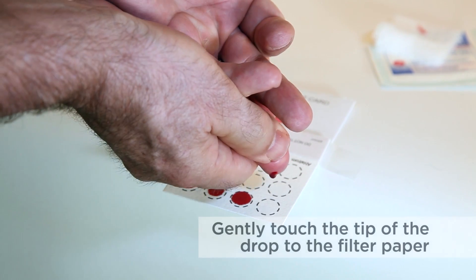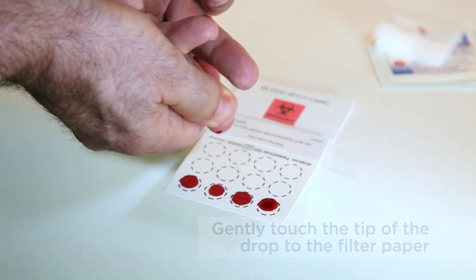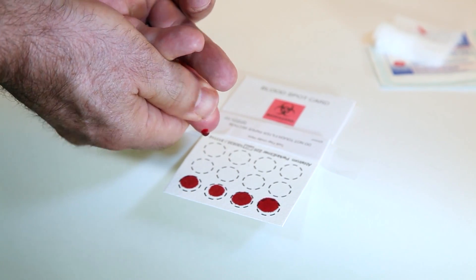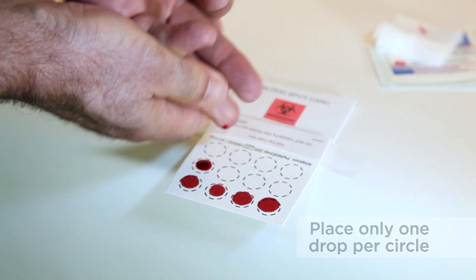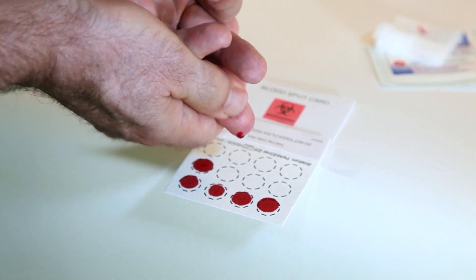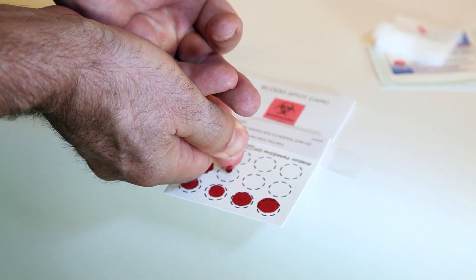When the blood drop is ready to fall, gently touch the tip of the drop to the filter paper. Do not press the finger against the filter paper. Place only one drop per circle. Each blood drop should fill at least three quarters of the circle. Continue to collect blood until all circles are filled.